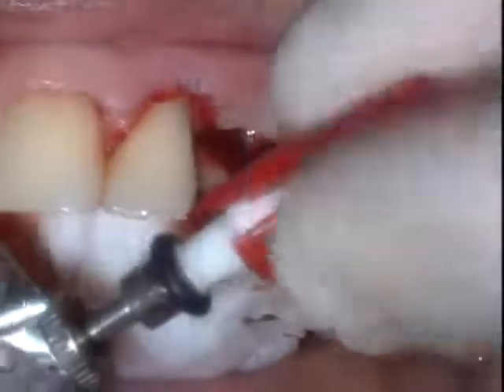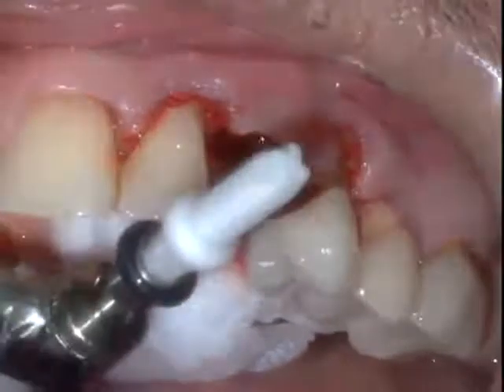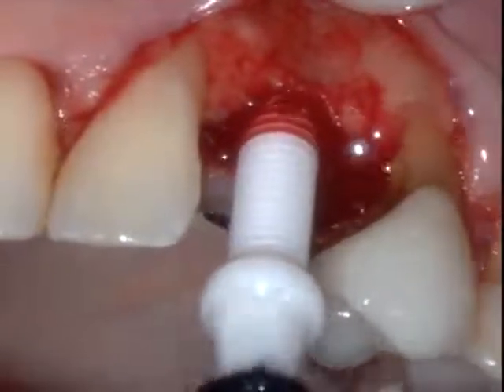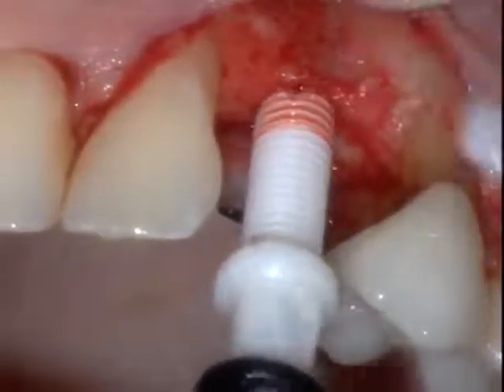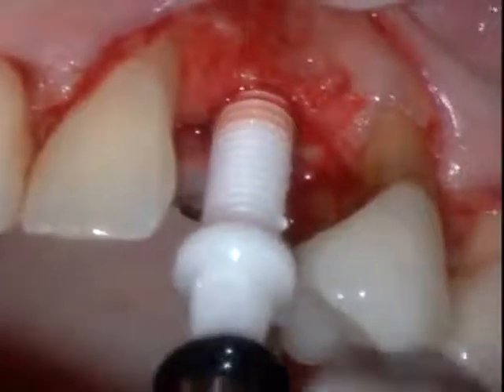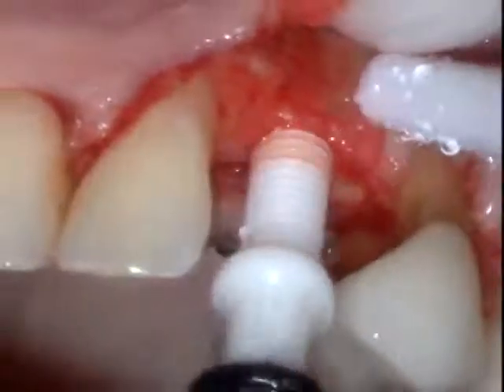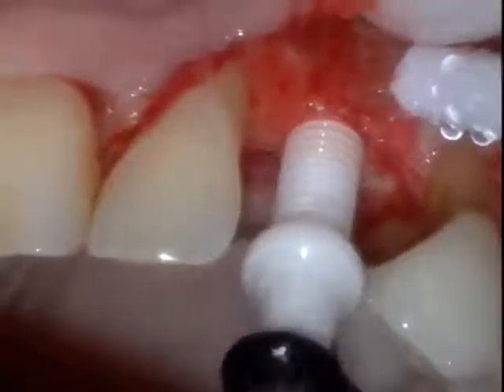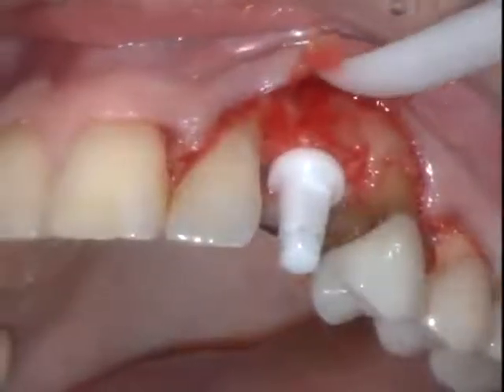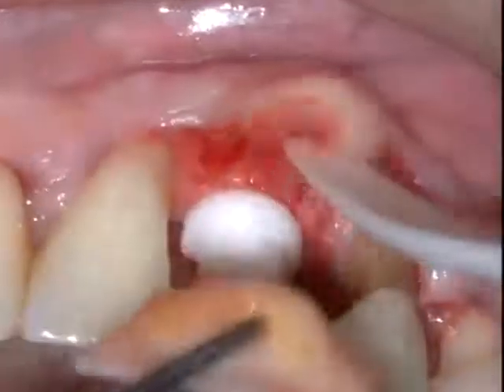This is the abutment, and this is the cartridge and carrier that is utilized to place the implant. It's a very easy system. You can see no contact is made with the gloves, and right from the carrier and the packaging, it goes directly into the mouth. A pure zirconium implant is then inserted. Following the bone tapping of the threads, we get excellent initial stability of the implant, and you can see the collar of the future canine is placed right at the shoulder, even with the adjacent buccal margins of the adjacent natural teeth.